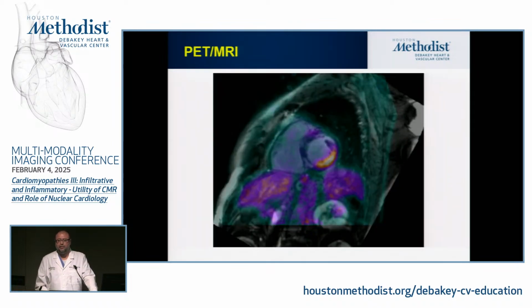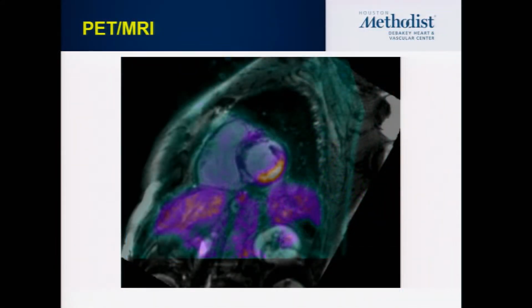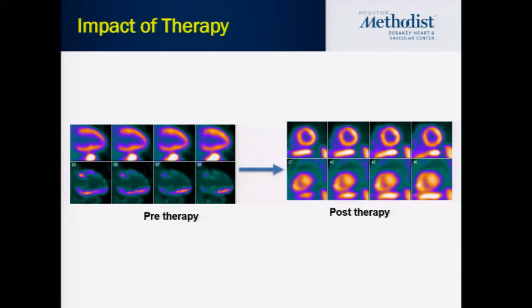There has been a lot of emphasis on PET-MR as a single machine, but the good news is that we can even fuse them and determine, for example, that this patient has a scar there which is not actively inflamed, and there is also another scar here, or LGE, with an area of FDG uptake. So you see two patterns in this patient: one prior scar which is probably not actively inflamed, another one which is actively inflamed. And we follow these patients.